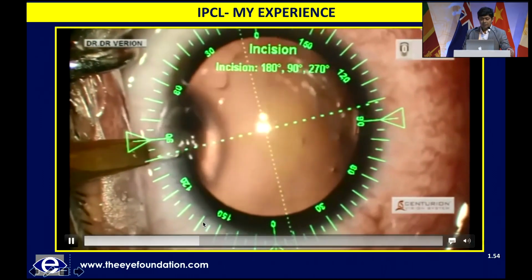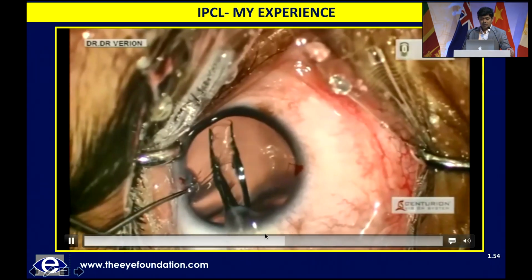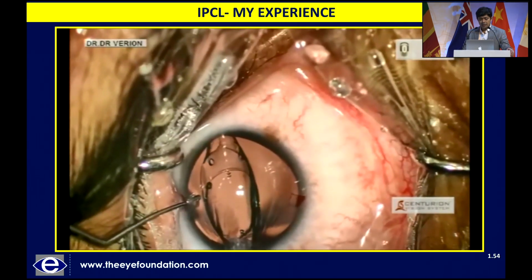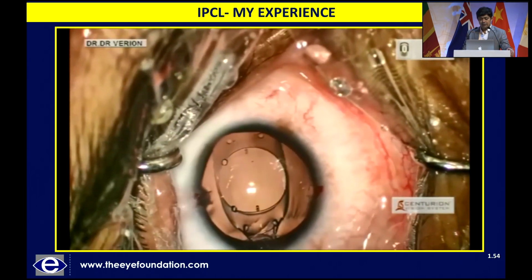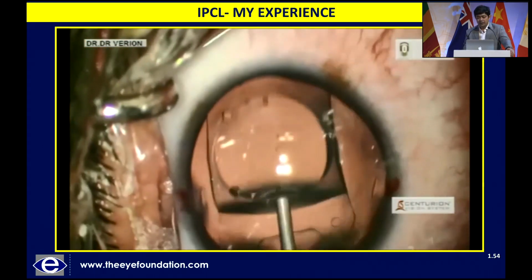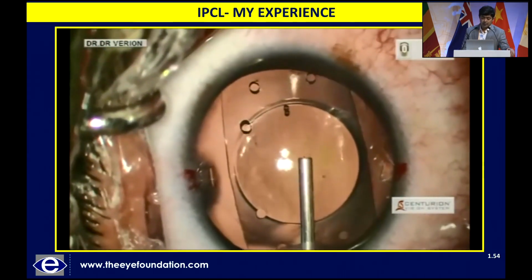Nowadays, we don't even use viscoelastics. I'll just speed it up a little bit. So the lens opens out very, very easily, very smoothly. You can either do it with irrigation or with viscoelastic, and usually it's a very nice, controlled, easy opening. And it goes through a 2.8 millimeter incision very, very easily. You don't even need a 3 millimeter incision that you normally require in an ICL.